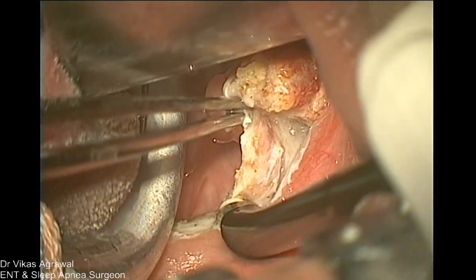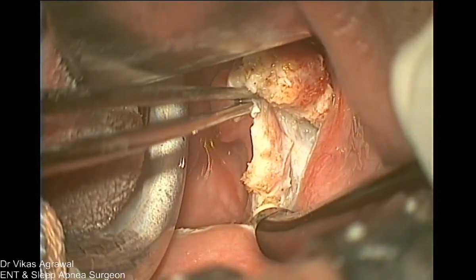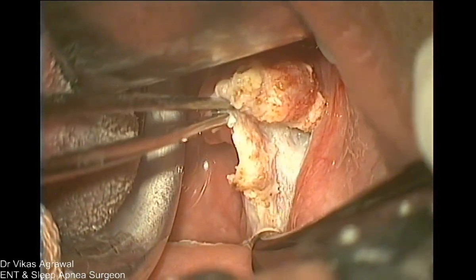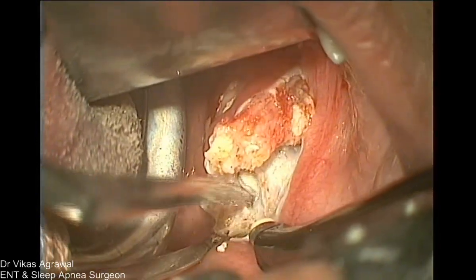Right. So now question, Dr. Vikas, is the supratonsillar fat, do you always remove it? Do you recommend always removing it, and do you always find it? So unless you go into the supratonsillar area, see, it's this area which is the bottleneck. This is the velopharynx. Right. So if you see how much lateralization has happened, see this?